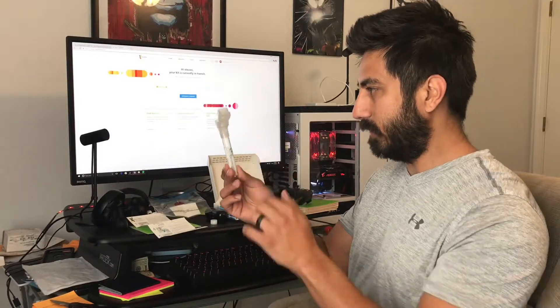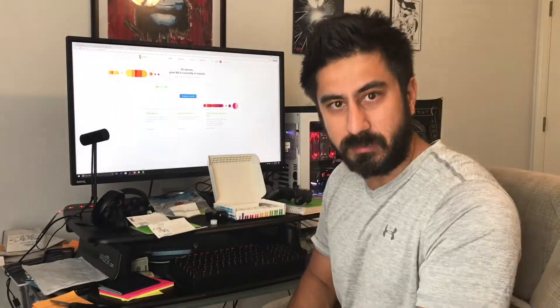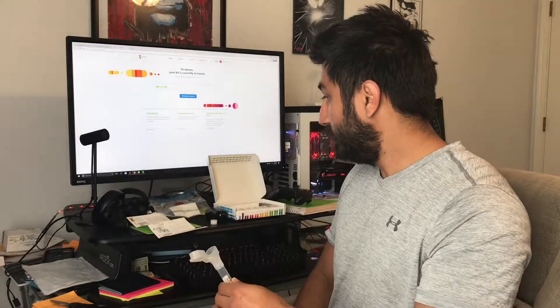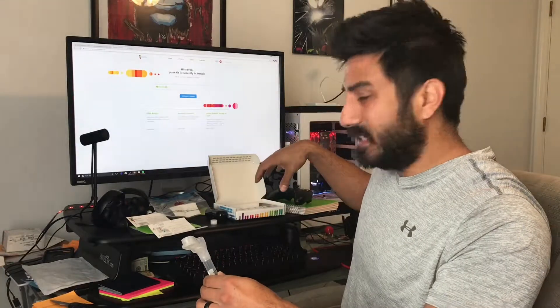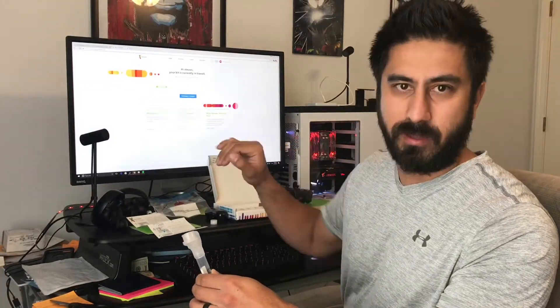I'm now at the stage where I have to fill this spit cup up to the fill line. You can't eat, drink, chew gum, or do anything like that for 30 minutes — I set a timer after brushing my teeth this morning. So I'll fill it, unscrew the cap, close it, and put it in the box. The cool thing is this box seals itself, so you don't pay shipping — it's already on the label.